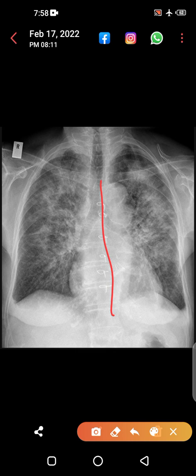The sternum is usually opened mainly for the heart — iska sternum open kia gaya tha. To do any work on the heart, they open the sternum. So the first thing here could be a CABG — coronary artery bypass grafting.